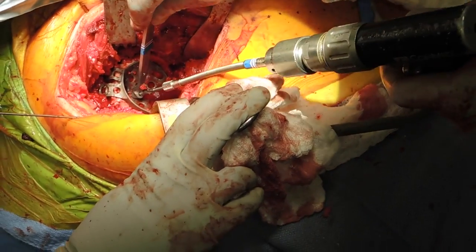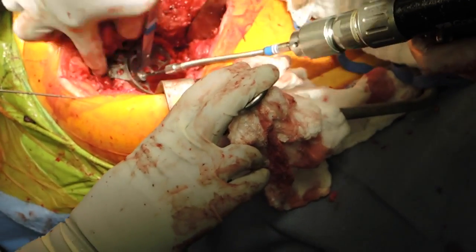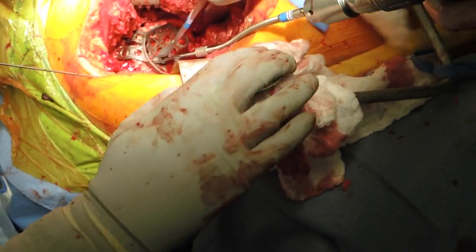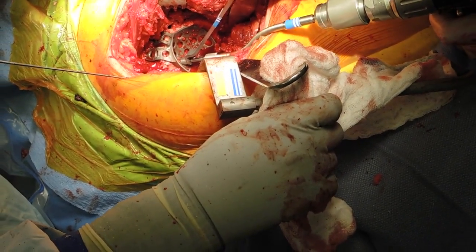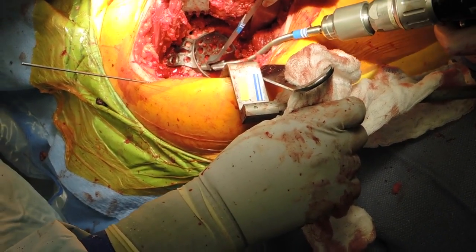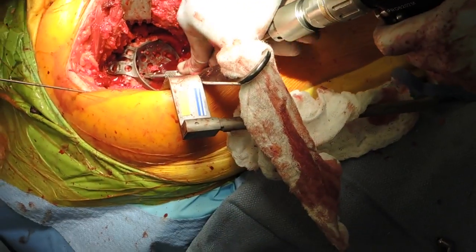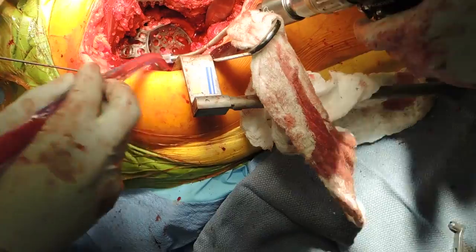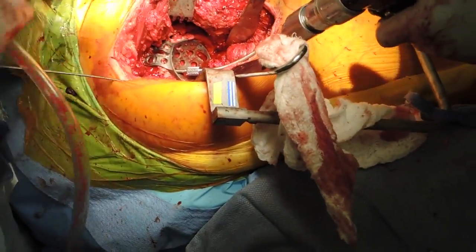Next, we will start to fill the dome holes first in order to compress the cage into the acetabulum. We want to make sure that we angle these screws away from where the flange screws will go so that we can fit as many screws as possible, both through the dome and especially through the flange screws into the ilium.